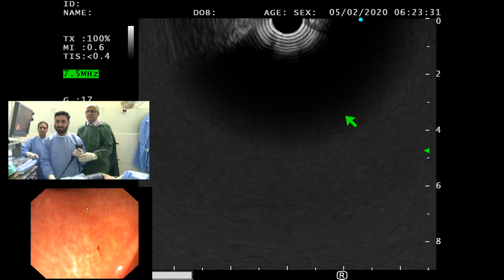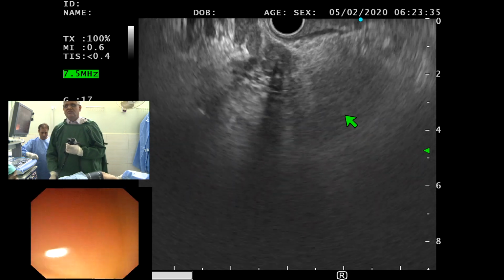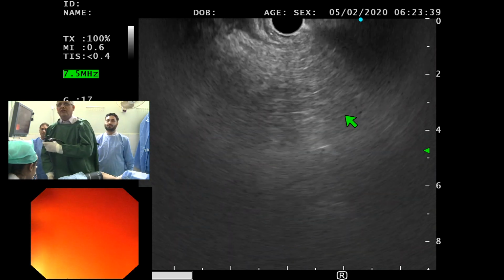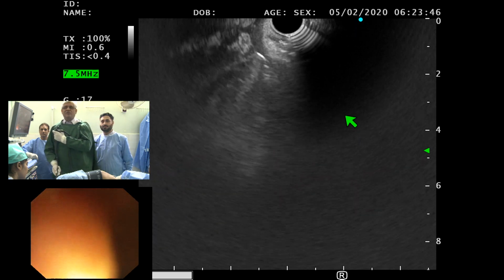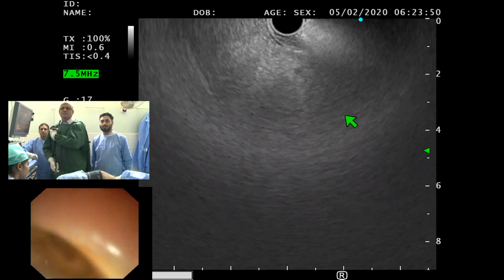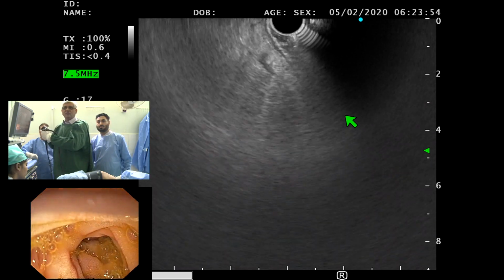So let me just take over here. The patient thoda sedation and so I'll have to take over. So you don't really have to bend down. You go in. So this, use my big wheel the other way down. So I'm not going to bend down or do anything. You don't have to do anything. You just need to pull yourself back. Okay? So once we've done that, we are now in the D2.